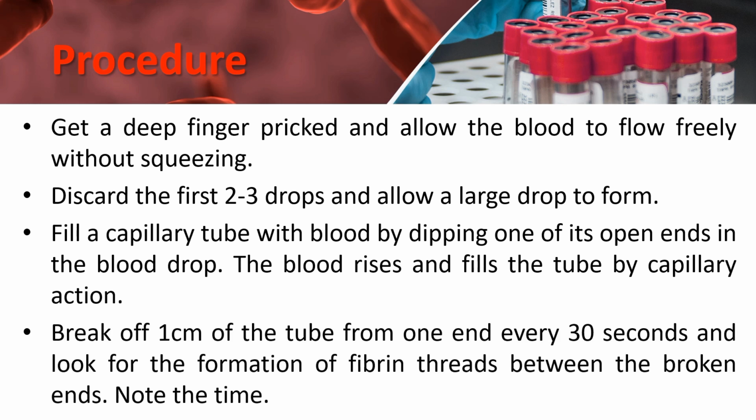Then break off 1 centimeter of the capillary tube from one end after every 30 seconds and look for the formation of fibrin threads between the broken ends. Note the time as soon as you see the fibrin threads. This is the clotting time.